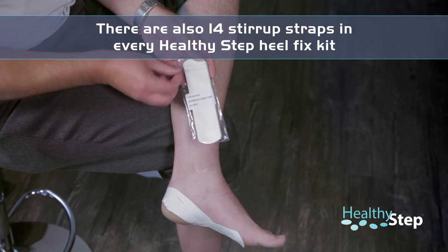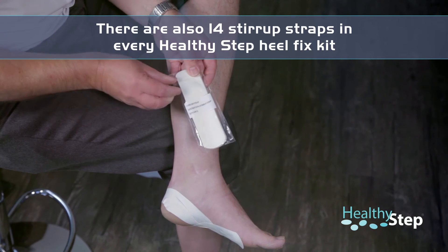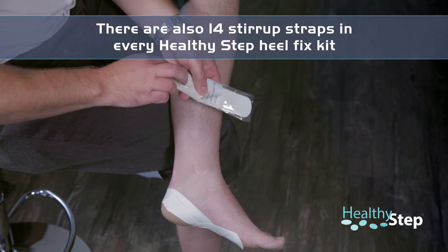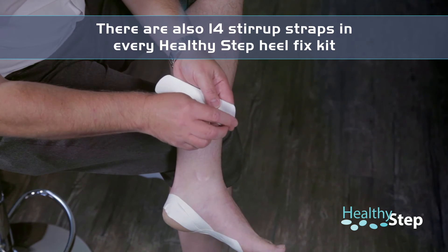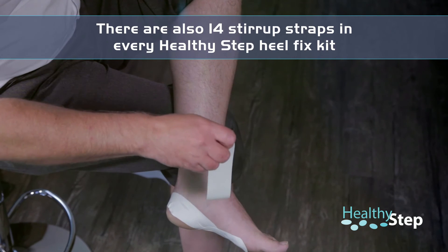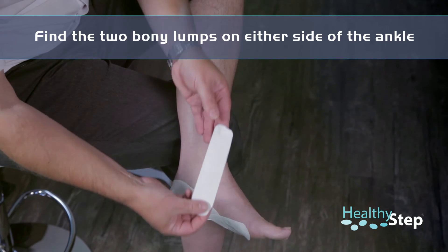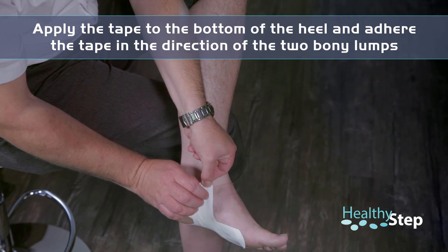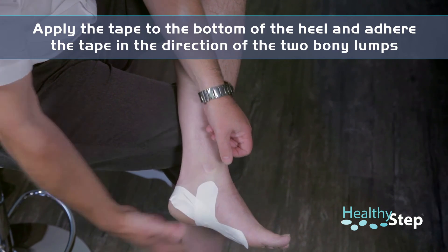Now open up the stirrup strap, which again contains 14 tapes inside. Remove the tape from the packaging and remove the backing. Look at your foot — you'll notice two little bony lumps on either side of your ankle. Apply the tape to the bottom of your heel and put it nice and firmly up towards those lumps at your ankles. As simple as that.